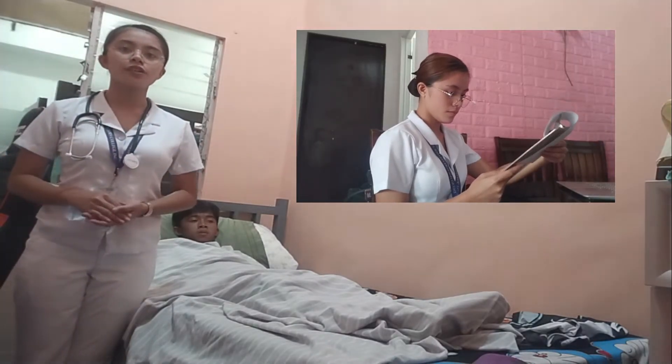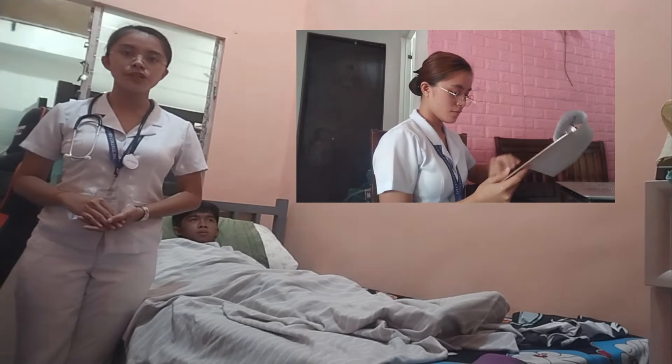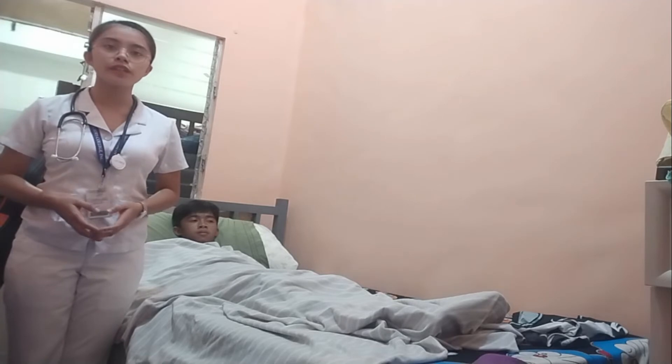Prior to performing the procedure, I have already reviewed the client's medical record and checked the doctor's order for the need to perform the assessment. This is to conserve time and energy. I have also prepared the necessary equipment and determined the scope of the assessment needed.